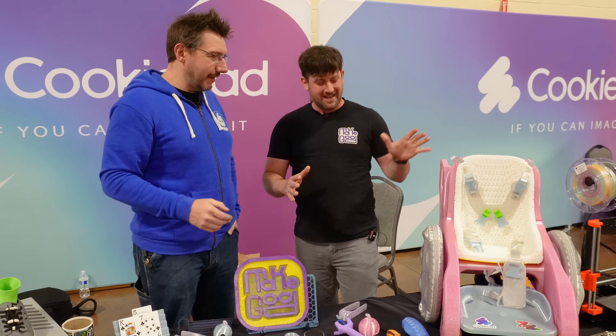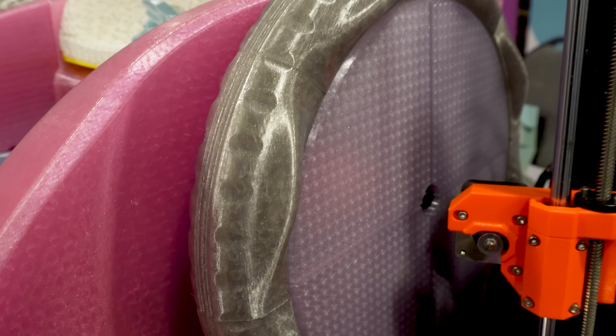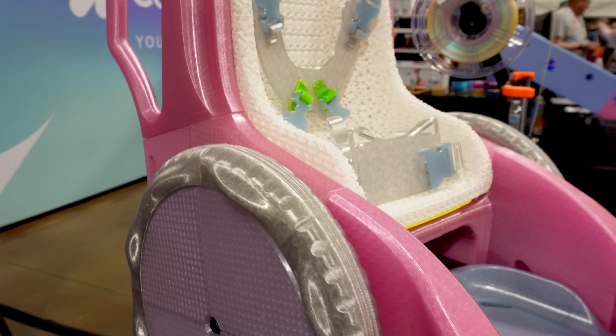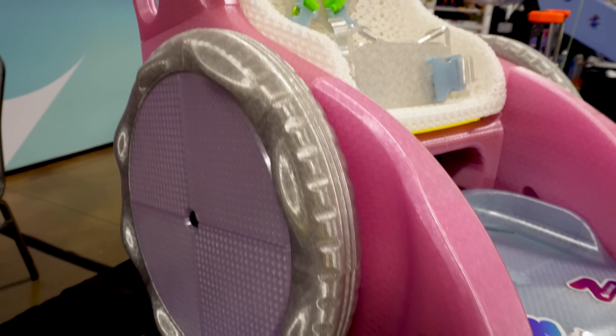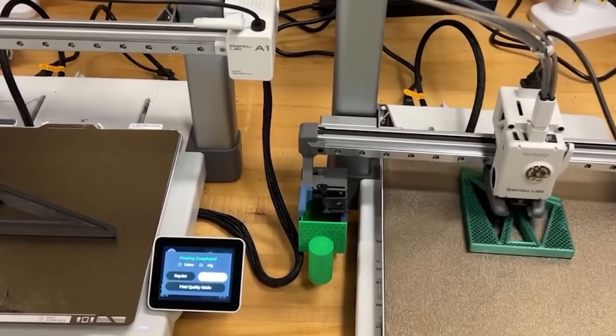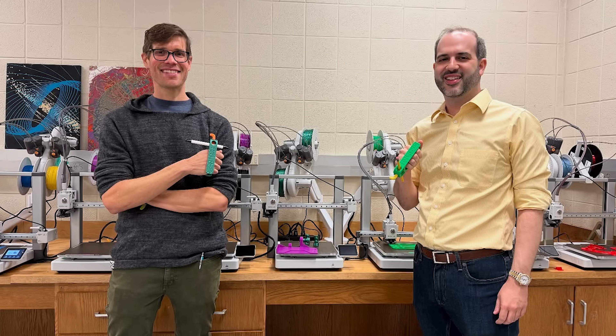A mobility trainer, and it's fully 3D printed. Everything from the tires, the wheels, the body, the seat, the straps, the buckles — the entire thing was made on a Bambu Labs A1. So a standard desktop 3D printer can make all the parts for a mobility trainer. That's exactly right.